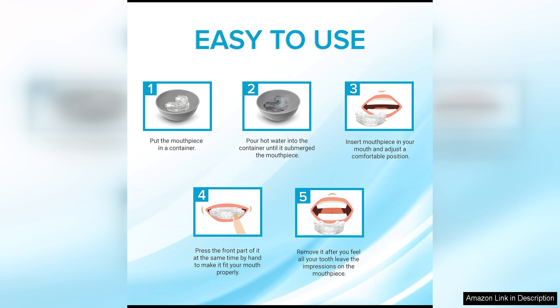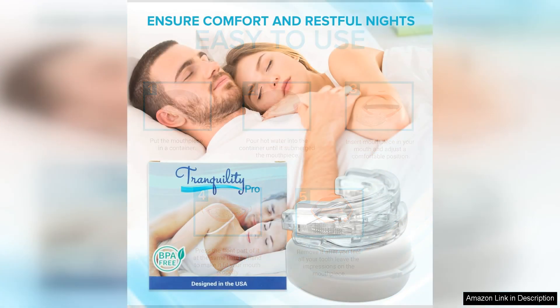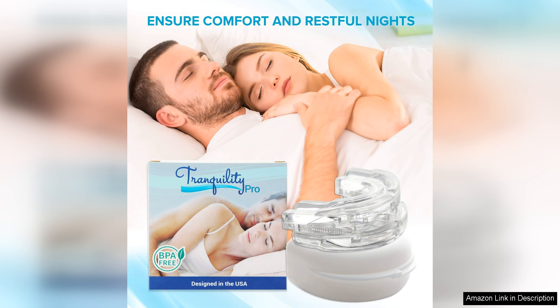It's also worth noting that the Tranquility Pro 2.0 is easy to clean and maintain. Simply rinse it off with water after each use and store it in the included case to keep it hygienic and in good condition.